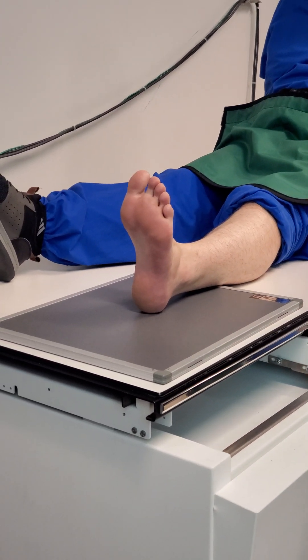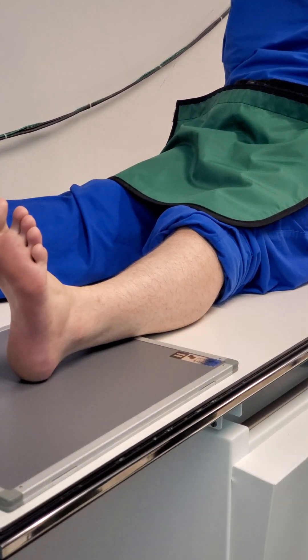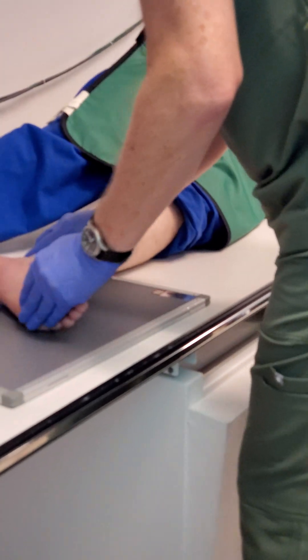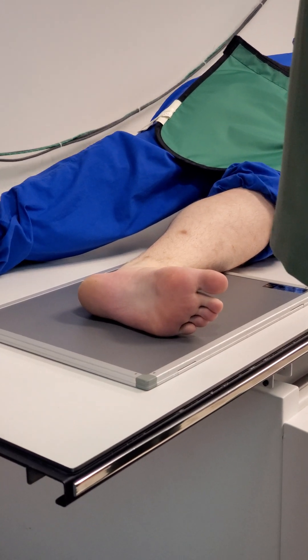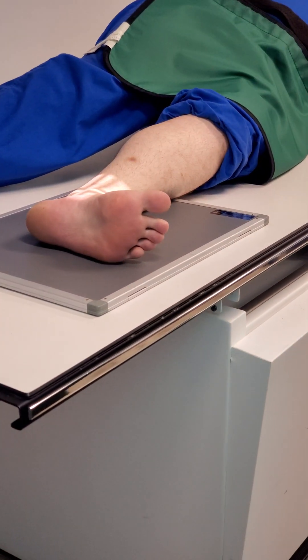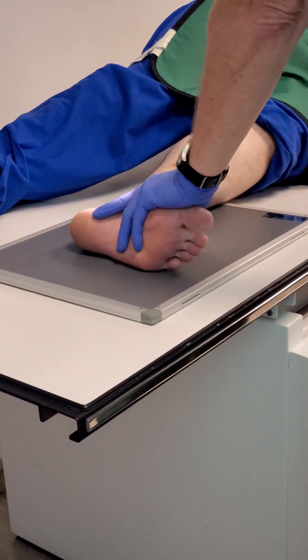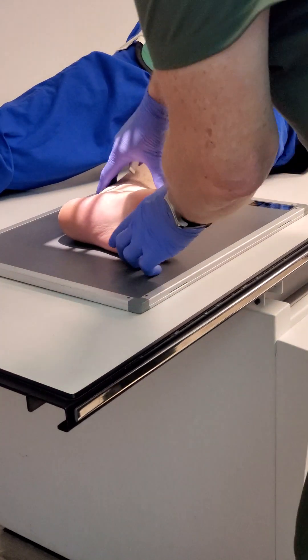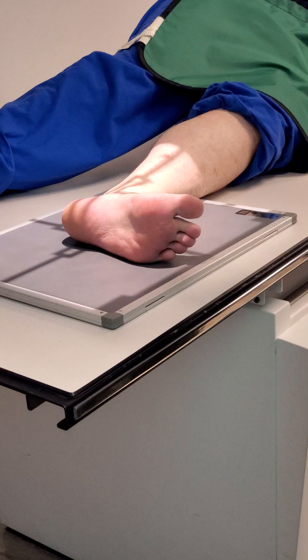Now go ahead — I'm going to put the table back down a little bit. Have you lie down and roll over to your left side. Bring the foot back, dorsiflex the foot again. Central ray needs to be one inch inferior to the medial malleolus — not mid shaft, that's for the other projection. One inch inferior to the medial malleolus. Center it in the IR as best as you can.